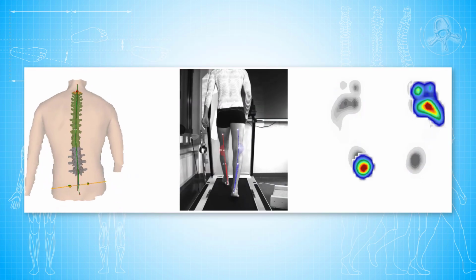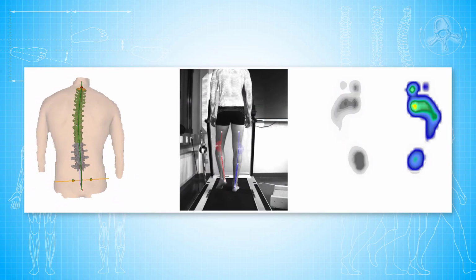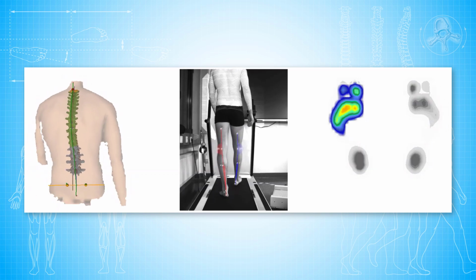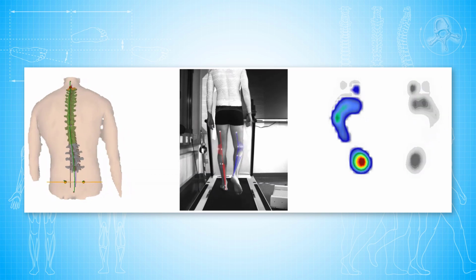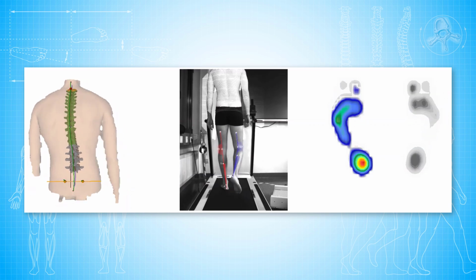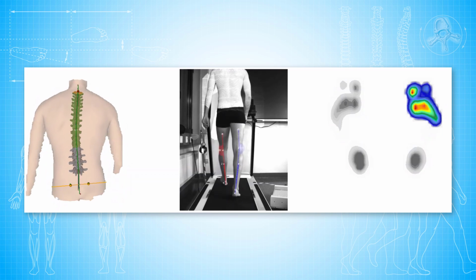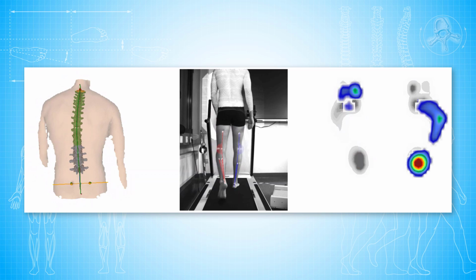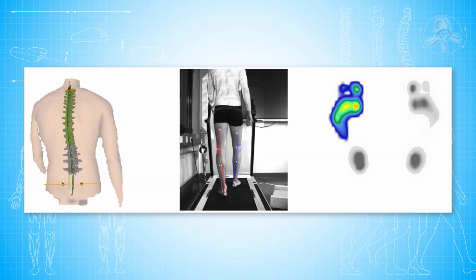At this point, a short word about the use of a treadmill in the context of clinical gait analysis. The treadmill is a means to an end. It offers upsides but also limitations that every user should take into account. The advantages certainly include the fixed and small space requirements of a treadmill system compared to diagnostics in open space and fixed ground.